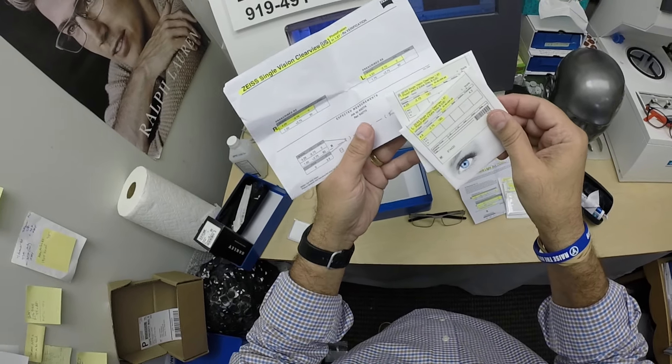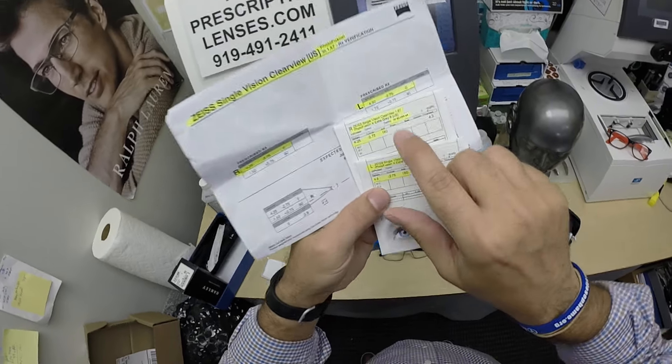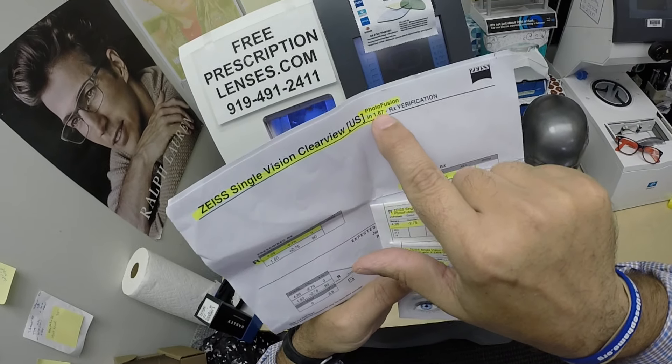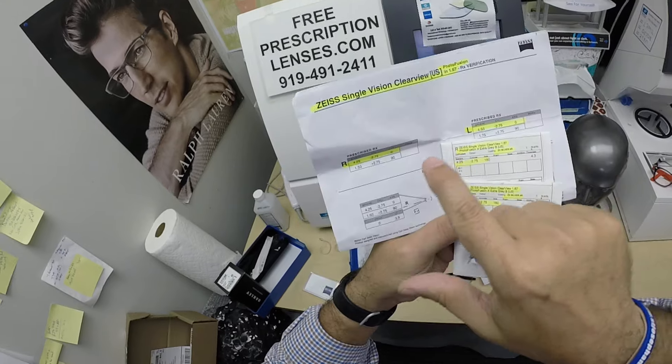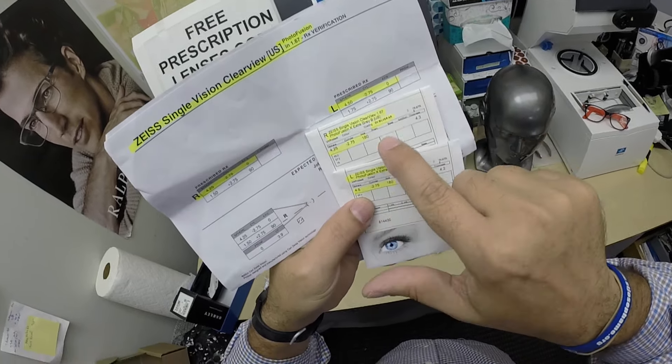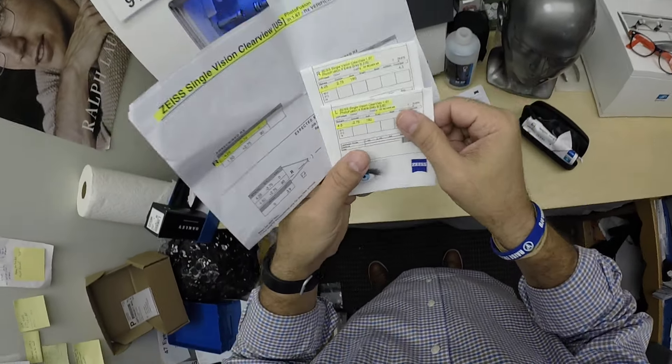But they can see, they can function, they can do great. He got the 1.67 high index. I've highlighted the clear view and 1.67 high index refractive index, the prescription for the right eye, the left, same for the lens packets — DuraVision Silver.